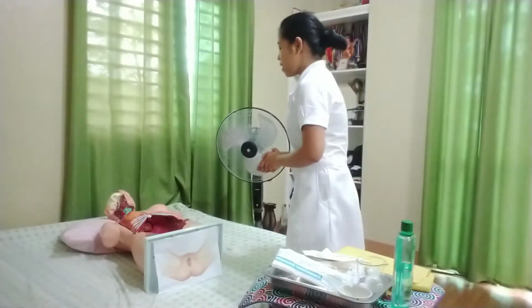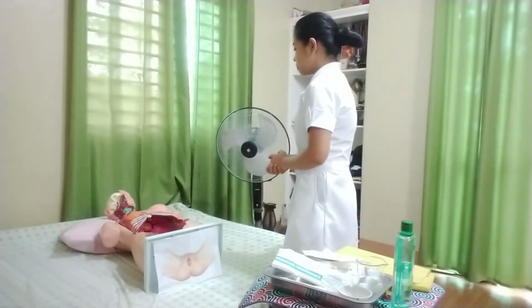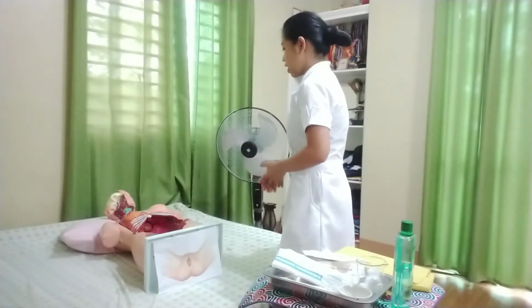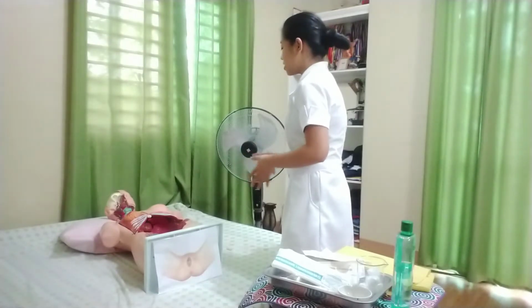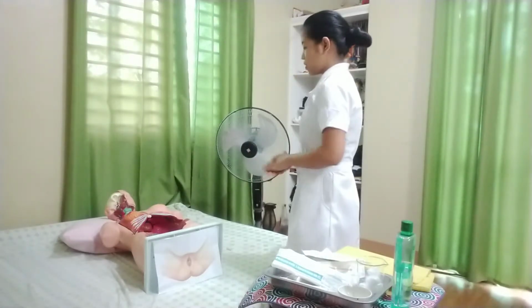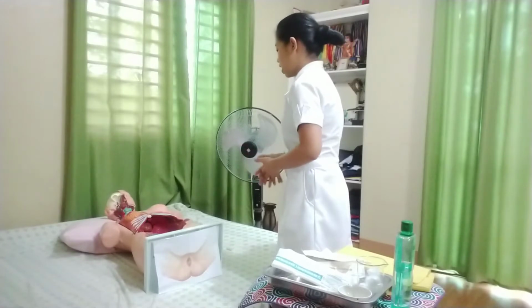So good morning, ma'am. I'm Isabel, your student nurse for today. May I know your name? Okay, how about your age, ma'am? Okay, good. So for today po, I will be inserting a catheter into your genital area. Will that be okay? This is to promote urinary drainage po, ma'am, and this is based on your doctor's order. Is that okay? Okay, ma'am. Thank you. So may I ask if you have any allergies? How about iodine or latex?